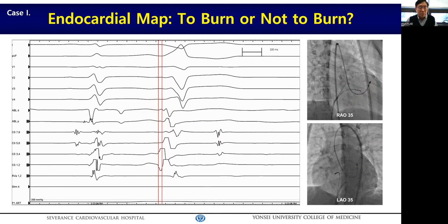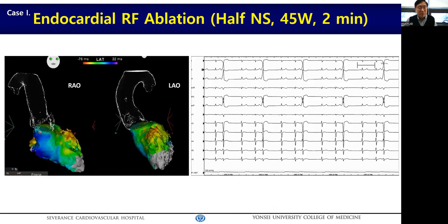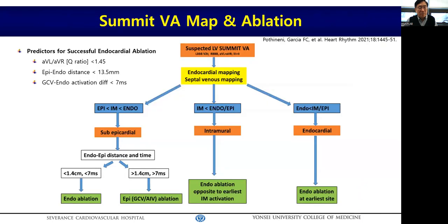So I can ask you, will you try to burn here or not? This one and this one. I did. I used half normal saline, 45 watts, 2-minute duration. But as you expected, there was absolutely no change.